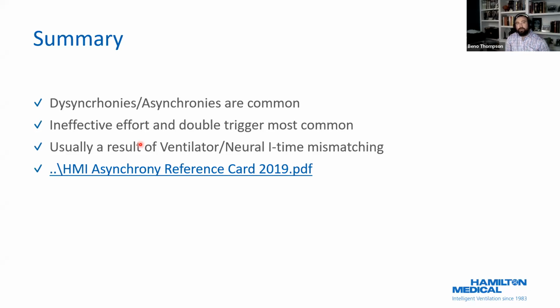Asynchronies are usually the result of ventilator and patient neural I time mismatching, right? They're just not in sync. And the waveforms will always help you figure out what's going on and how to fix it if you know how to read them right. Ineffective effort and double trigger, definitely the most common ones. Definitely double trigger. Everybody sees that all the time.